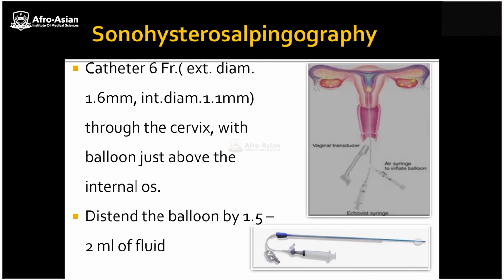So we will pass it through the vagina, then through the cervix, with the balloon just above the internal os.